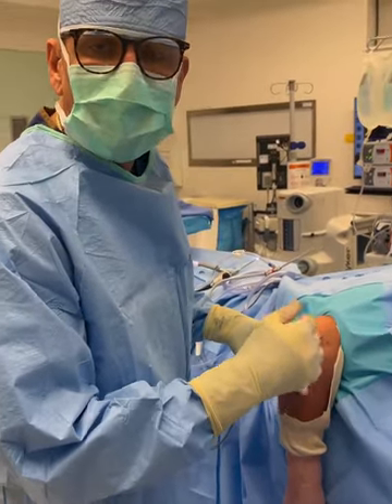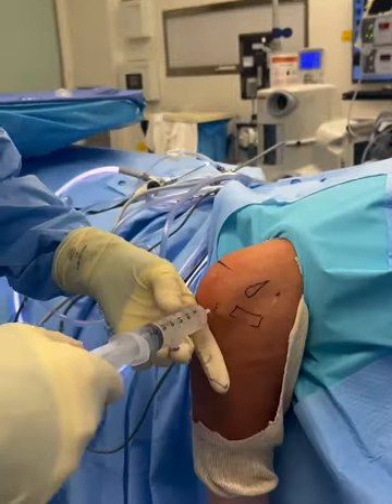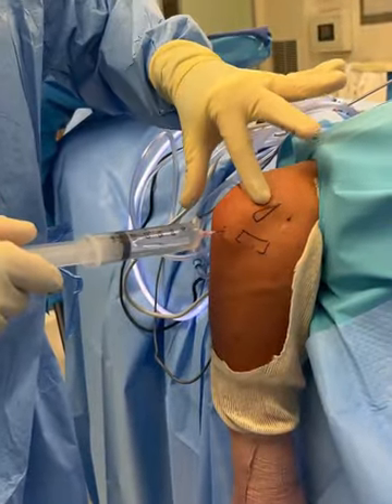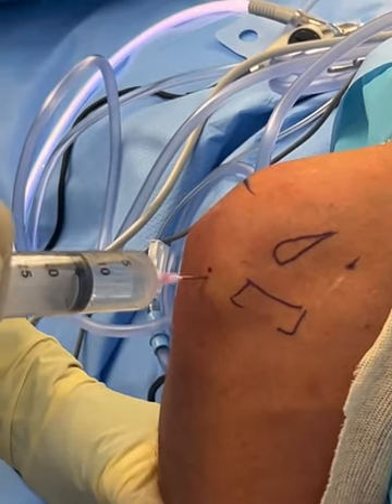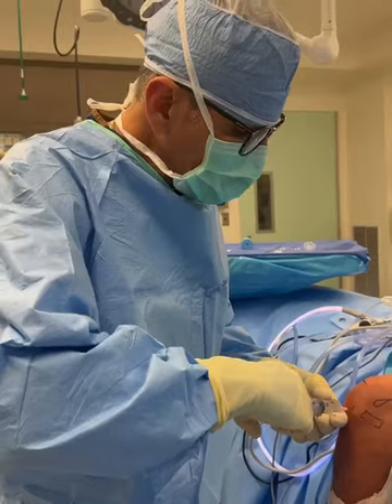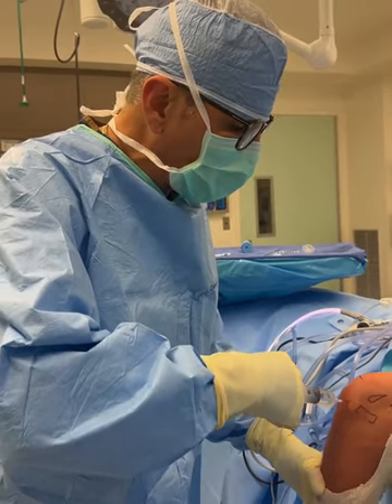This patient is suffering from what I've coined 'cauliflower elbow.' Cauliflower elbow is a condition that happens in young athletes. I've marked off my anatomy here — radial head, capitellum — that's going to be my portal site. I'll be putting a camera in the elbow, removing all loose bodies that are floating around, and then recontouring the distal end of the bones, finally releasing the capsule so that the patient can once again fully extend.